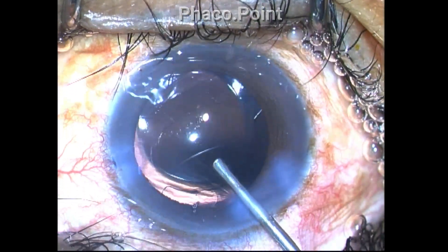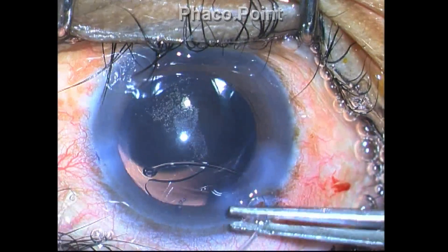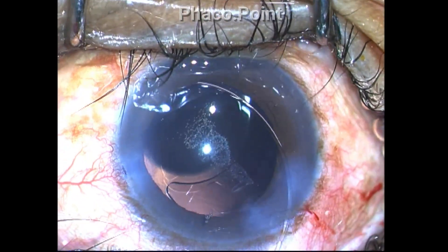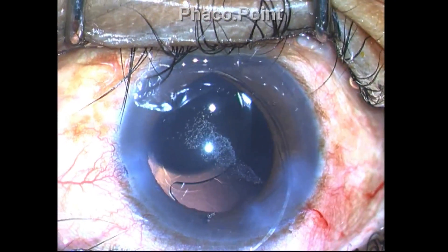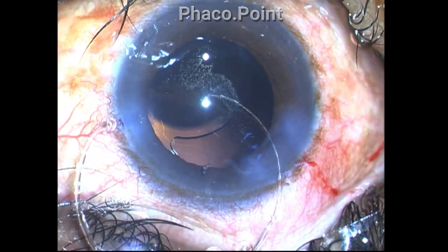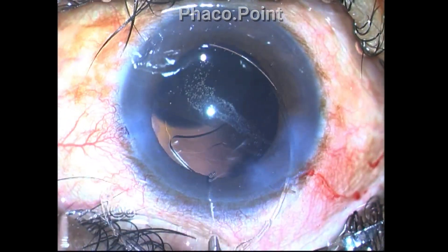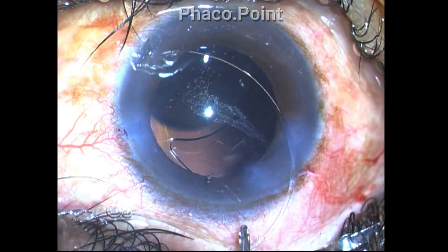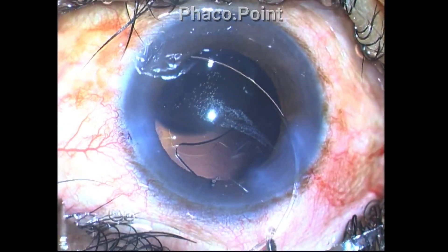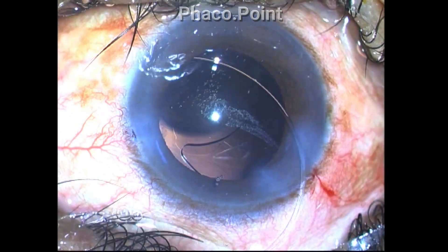I took a decision to implant a capsule tension ring. The first time I attempted to put the ring, the leading loop simply bounced off the IOL optic and went into the sulcus. I reattempted the insertion, this time taking a more steep angle of entry, and I was able to get the capsule tension ring within the capsular bag. I was threading the ring gently into the capsular bag, then using a Sinski hook I attempted the final insertion, but the ring slipped.